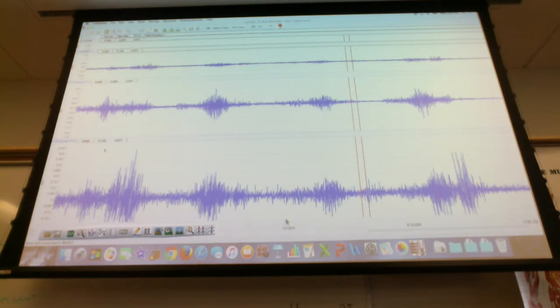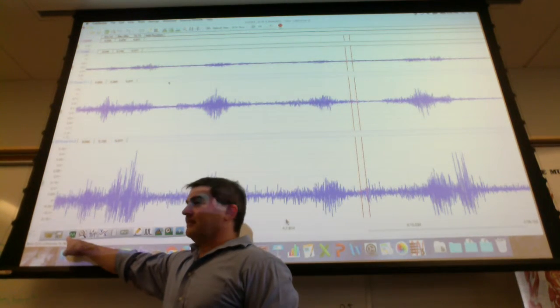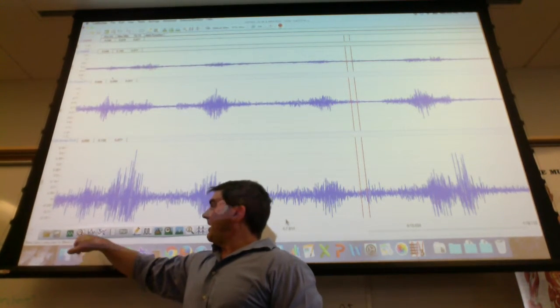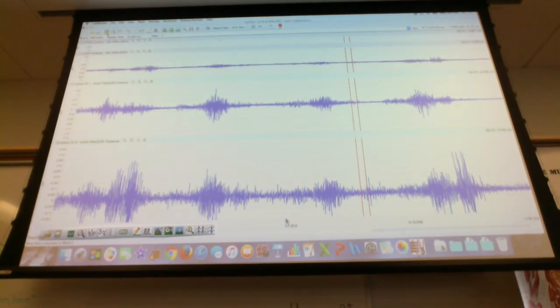So you're going to go back to the recording window by going over here. You're going to click on that to get back to the recording menu. And then, of course, you can hit record, and then you can do your stuff with the dumbbells.